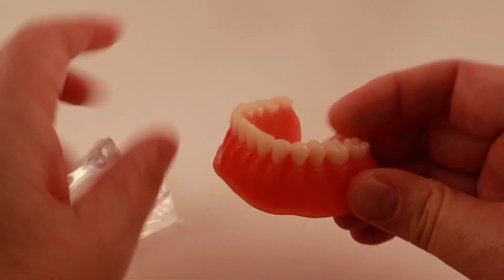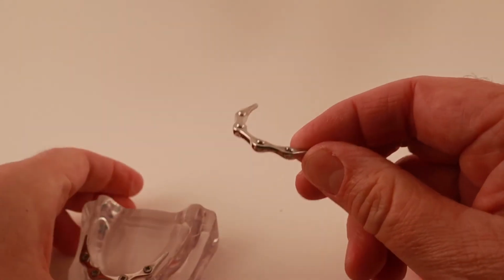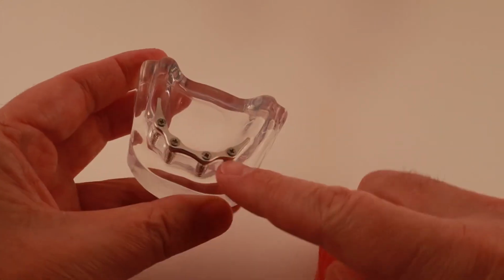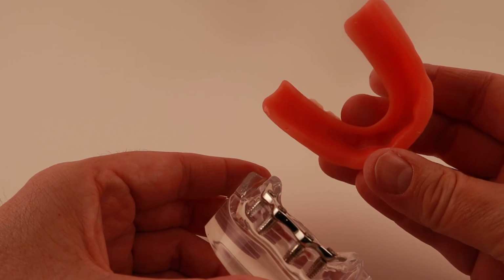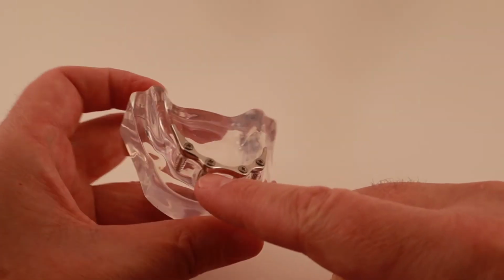Once the overdenture is made with the metal framework inside it, I'll attach the snaps to the overdenture while you're in my office. For an implant-supported overdenture, I start out by making a good denture as well as a metal bar that attaches to your implants. The inside of the denture needs to be made out of metal so that it could fit onto the metal bar and clip onto it securely. If the denture used only plastic, it would wear out quickly from rubbing on the metal bar.